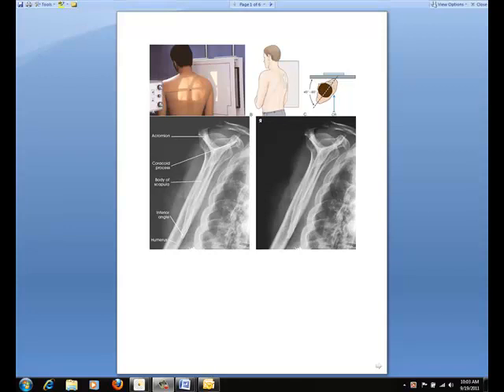The position and images you see before you are from a PA oblique projection, also known as a scapular Y, or a lateral shoulder. The body of the scapula forms the vertical component of the Y, and the acromion and the coracoid processes form the upper limbs. This projection is useful in the evaluation of suspected shoulder dislocations.